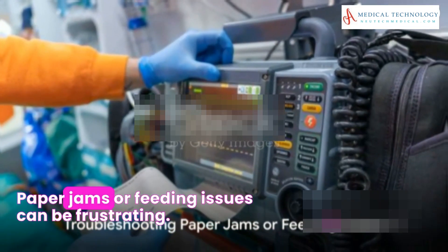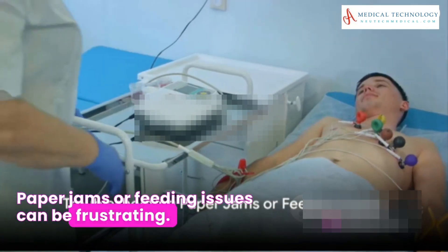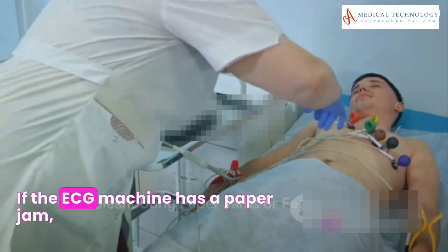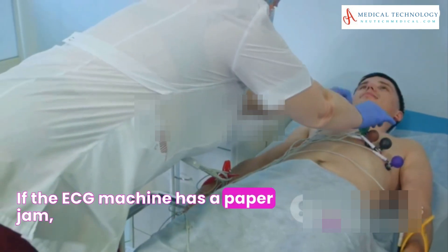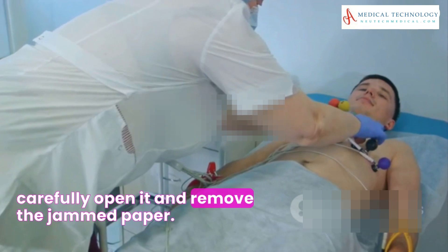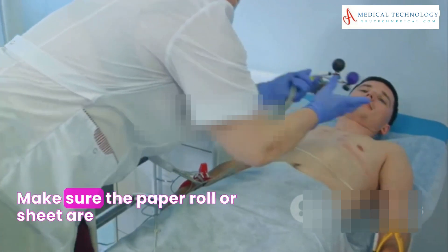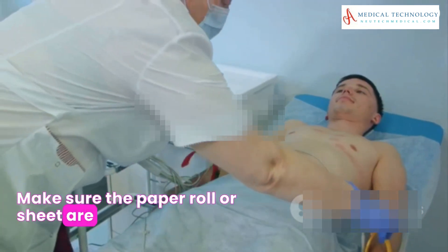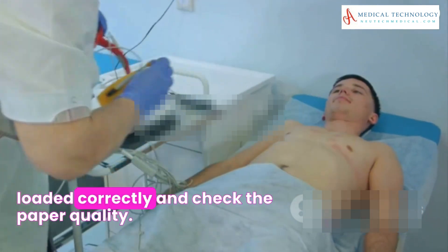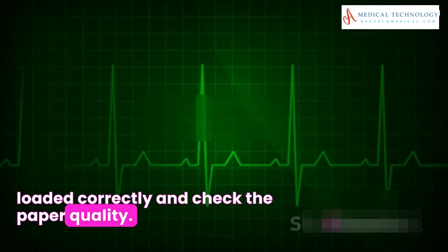Paper jams or feeding issues can be frustrating. If the ECG machine has a paper jam, carefully open it and remove the jammed paper. Make sure the paper roll or sheets are loaded correctly and check the paper quality.